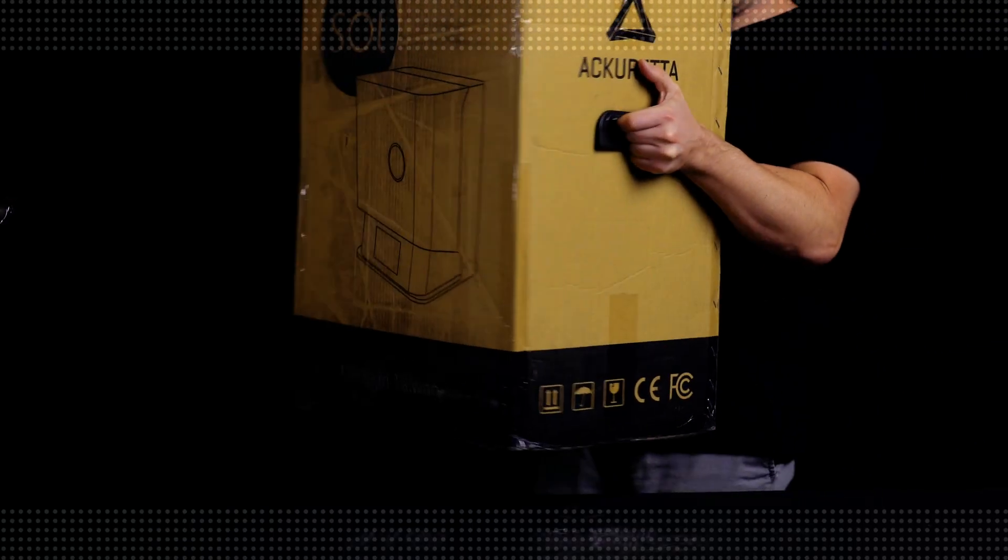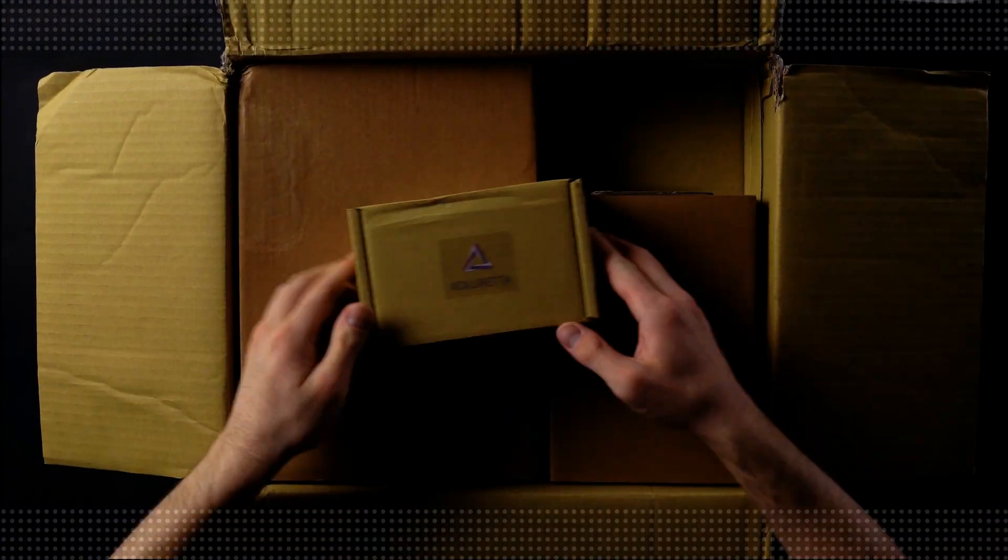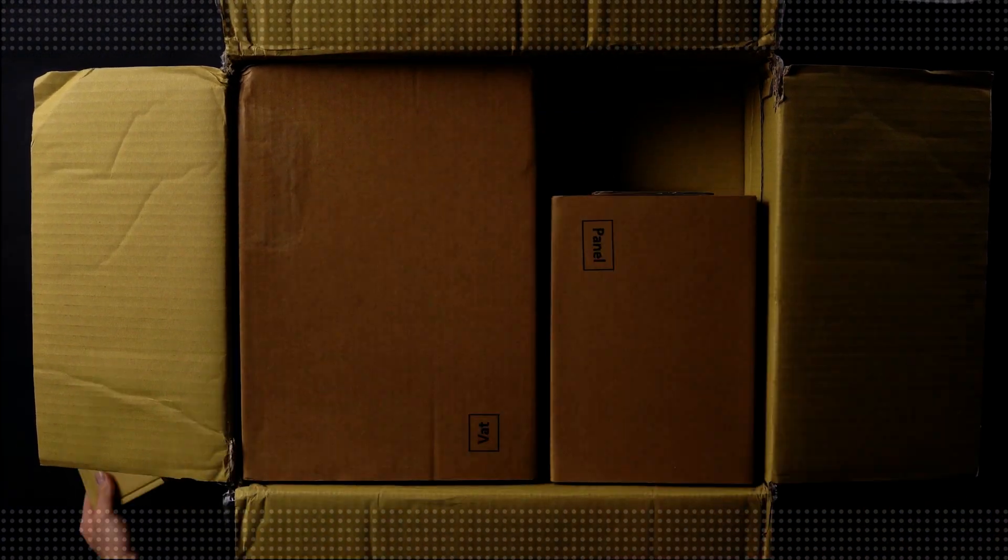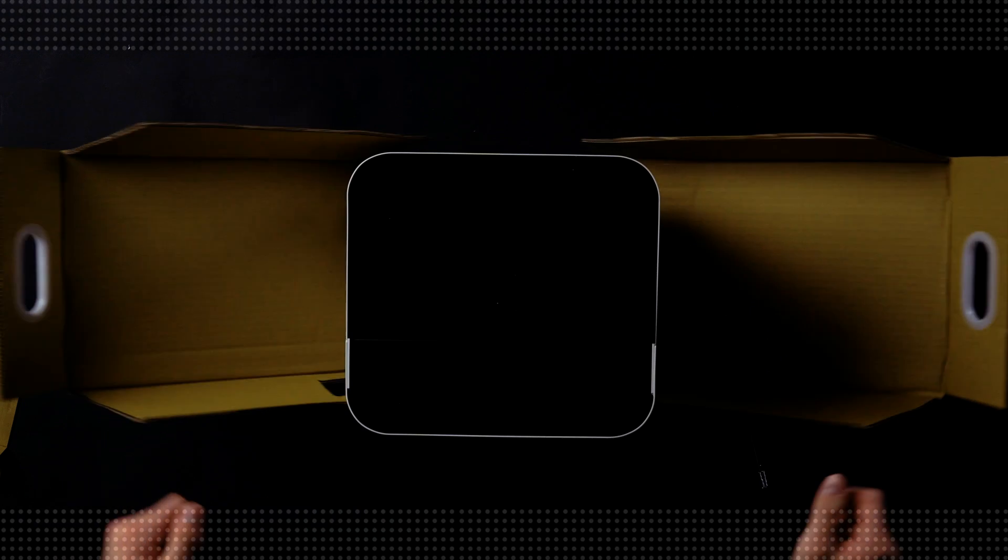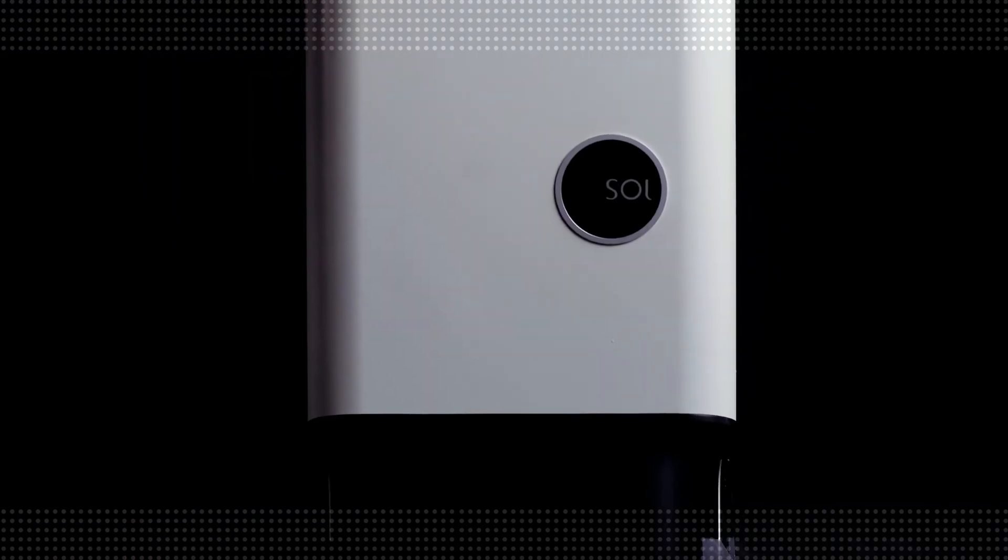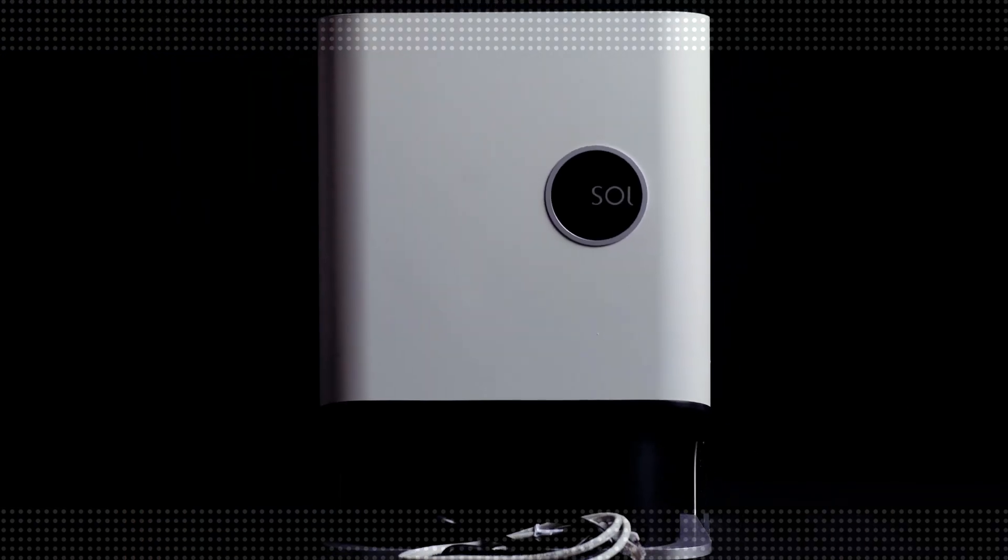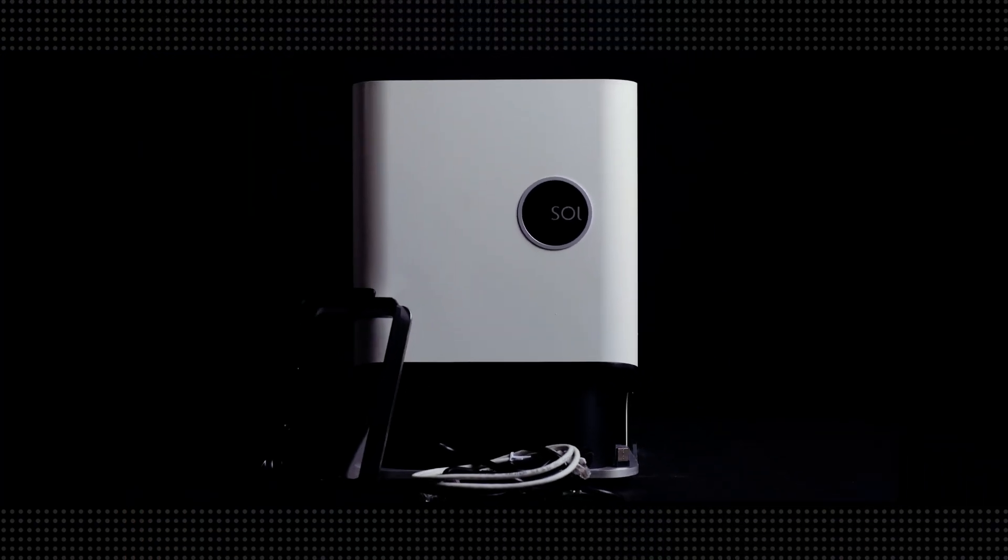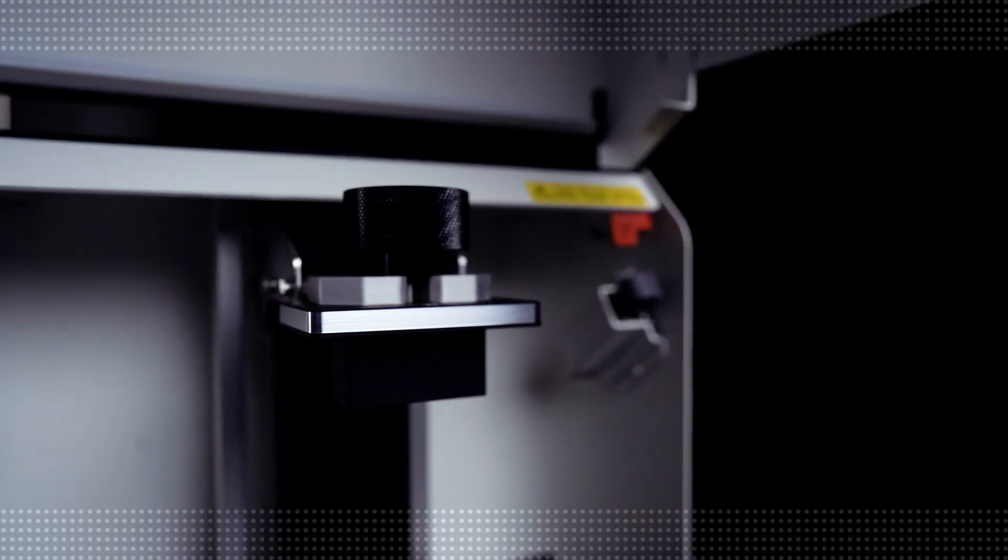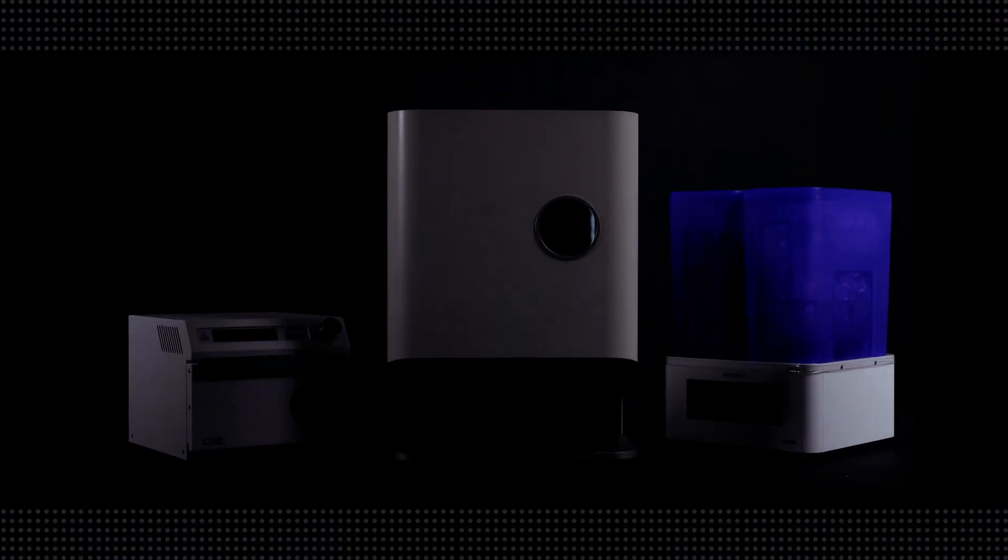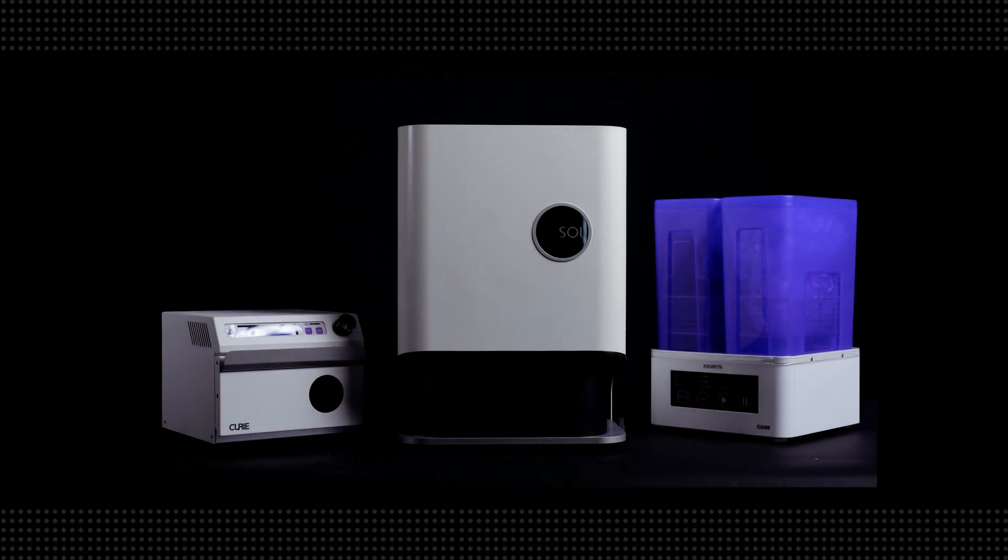We've been excited to get our hands on this small form factor printer for some time. Ackuretta is a Taiwanese company that has been manufacturing 3D printers for nine years. First released in 2021, the SOL represents their latest iteration in in-office printing. Ackuretta is one of the top five leading 3D printers in dental at the moment. It's a machine we've described throughout our testing as small and mighty.